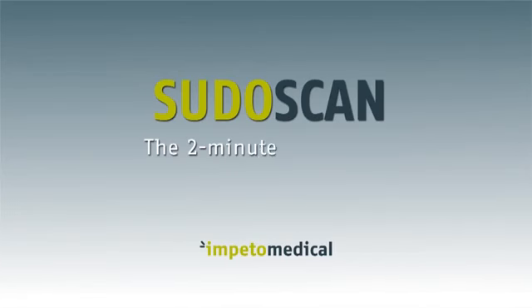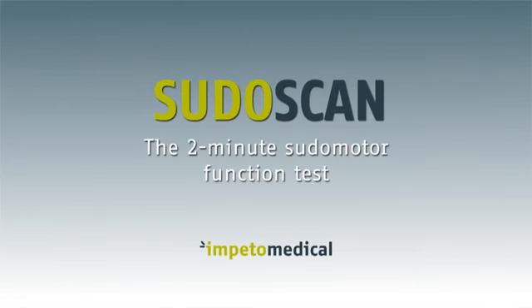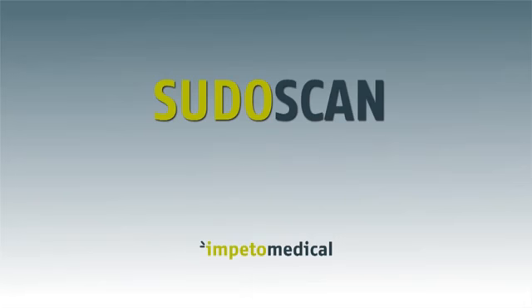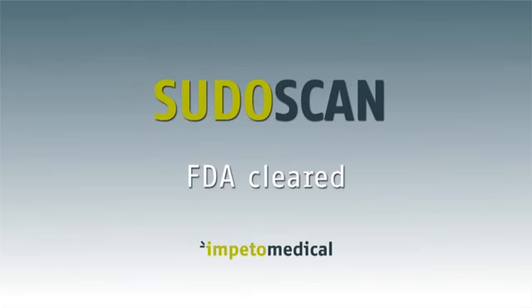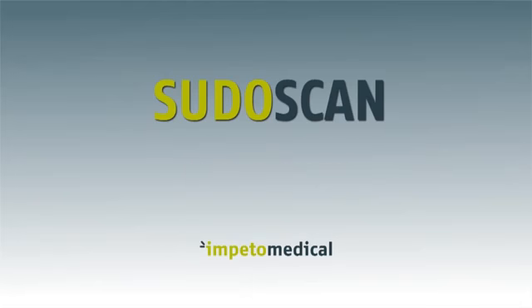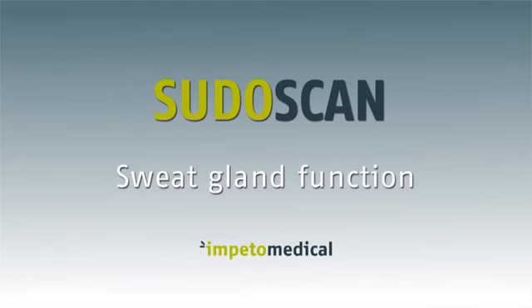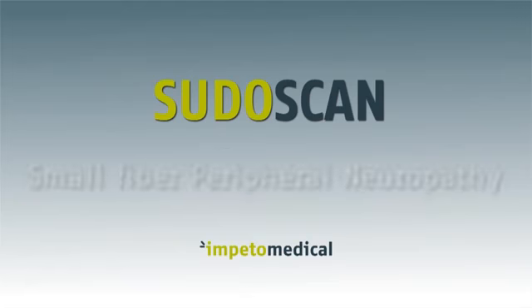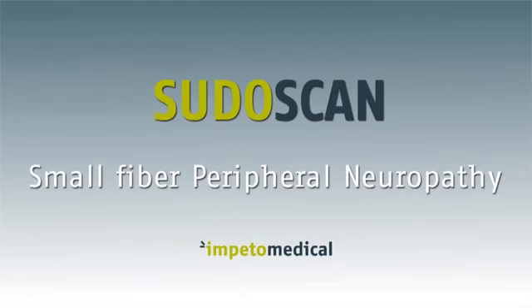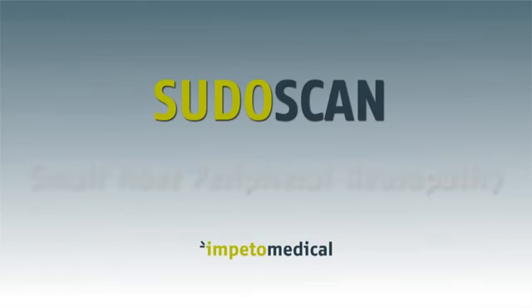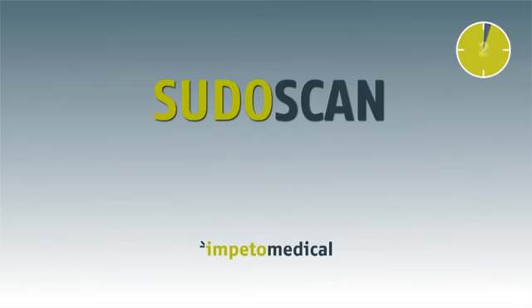SudoScan, the 2-minute sudomotor function test. SudoScan is an FDA-cleared medical device that measures sweat gland function as an indicator for small fiber peripheral neuropathy. The test does not require specialized training, preparation, or certification, and only takes 2 minutes to perform.